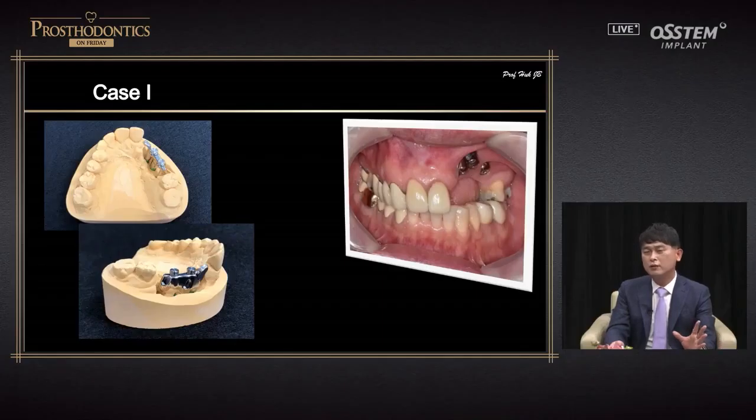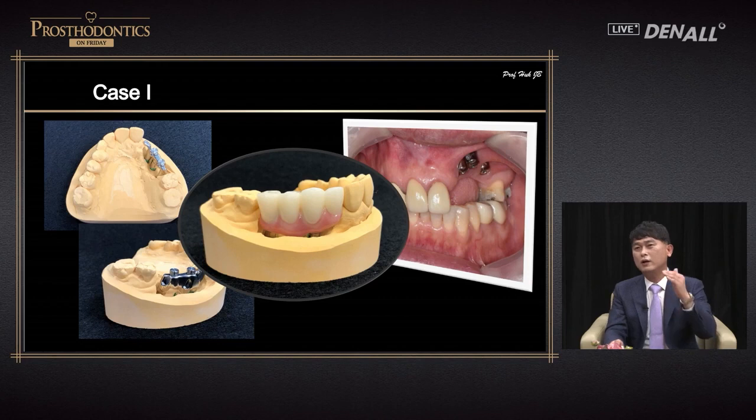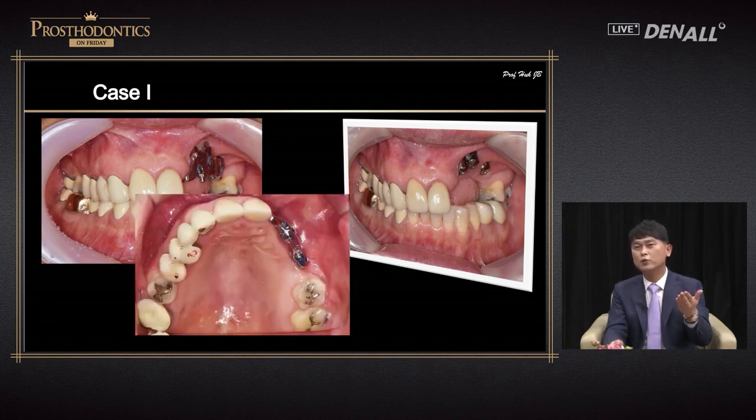Anyway, bars need to be made. Let me explain the concept. Instead of making alveolar bone using bone augmentation, just like we make a maxillofacial prosthesis, alveolar bone is made using the bar of the prosthesis. So I made it like this. The zirconia removable prosthesis is delivered to the patient. Supramargin is made and the patient can pull it out. After that, on the palatal side, a little bit of gap is created so that a water pick can be used for cleaning.